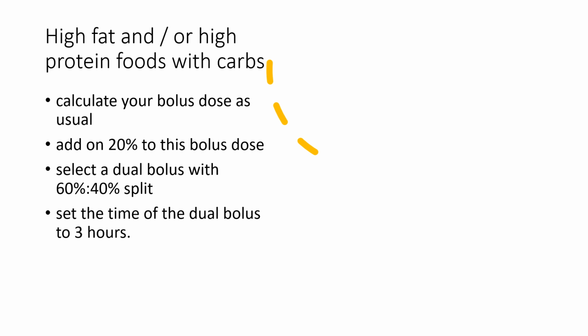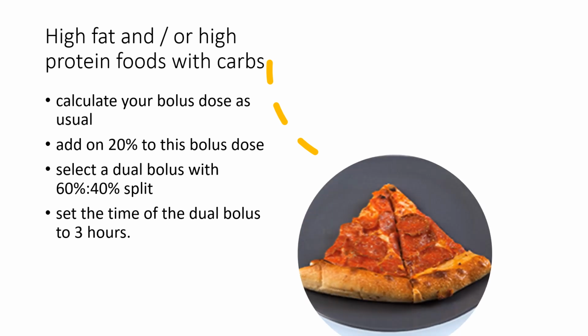The guidance for bolusing for high-fat, high-protein foods is based on research, but the evidence base is variable, so this advice is similar to the advice for managing alcohol and exercise. The approach required will vary between individuals and may not be for everyone. It will be important to work with individual experience. Some people may see an effect at lower or higher fat and protein levels. Some may see no effect at all.